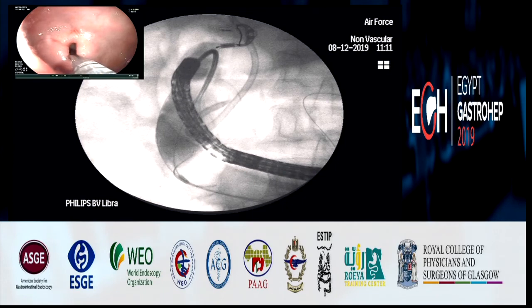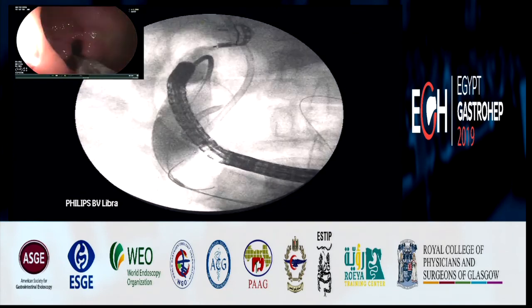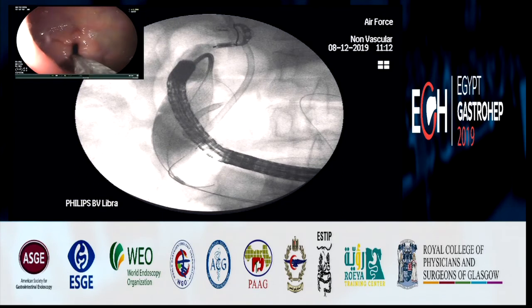Normally at the end she has to remove a security flange and wire here, and then she can deploy the stent almost completely now. And I'm still pulling on the outer catheter. Normally in a few seconds it should be done.